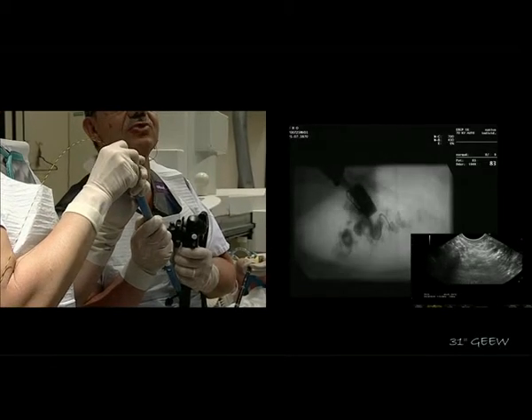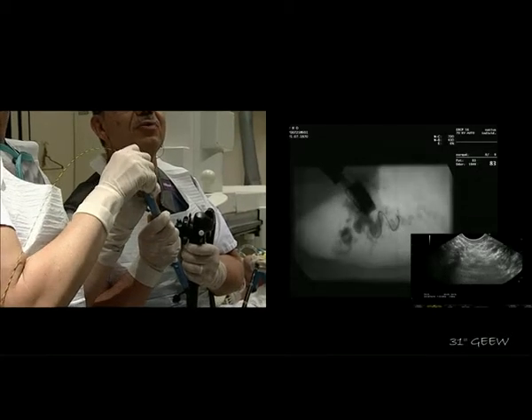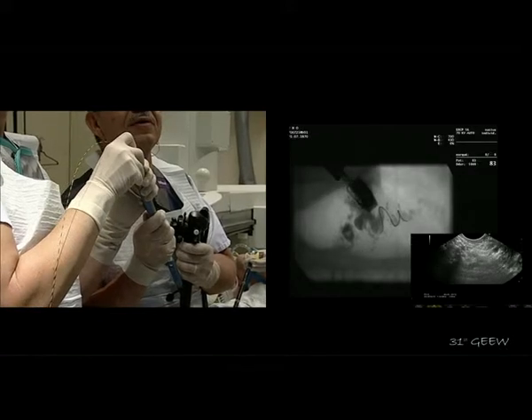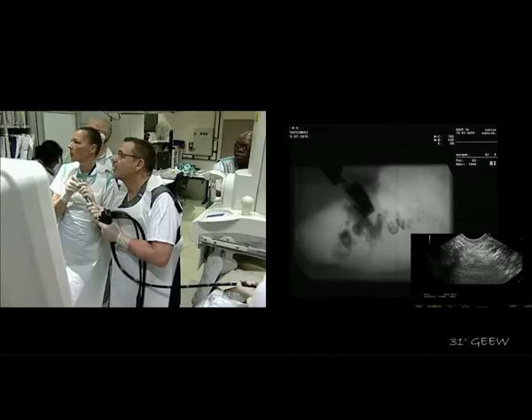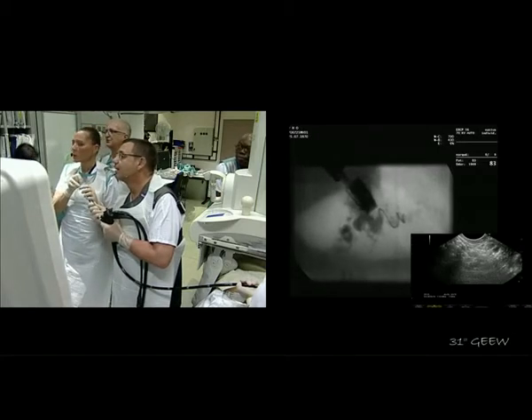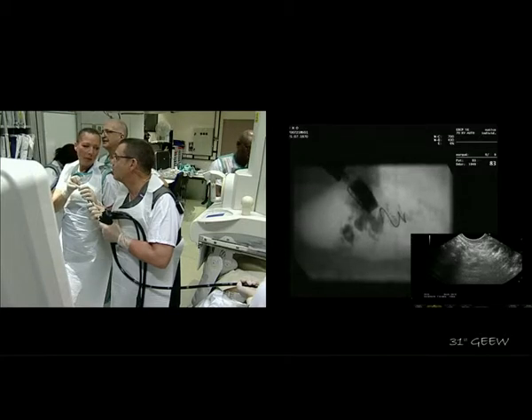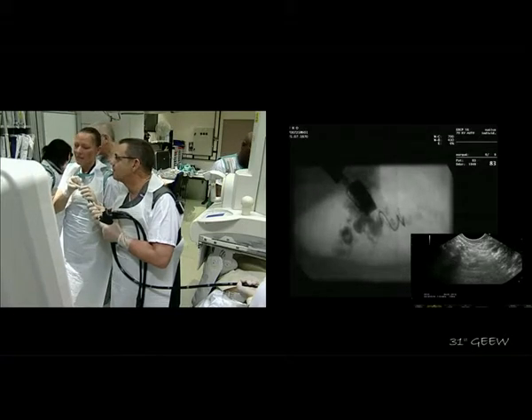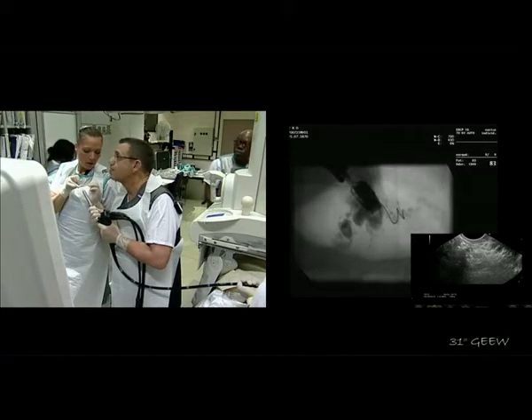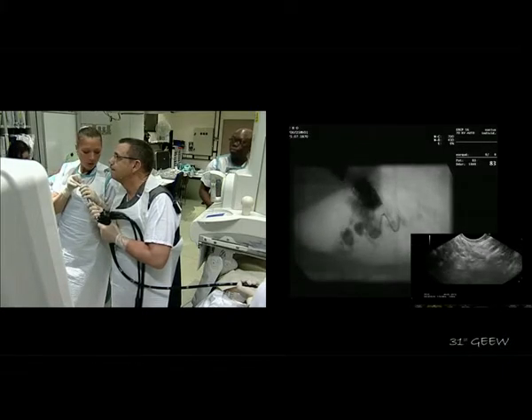Fantastic, Sonia. Fantastic. Okay, excellent. We do the exchange. Okay, that's very good. And I think that if we can stay like that, not move... Just make sure that we are in pure cut. Attention.